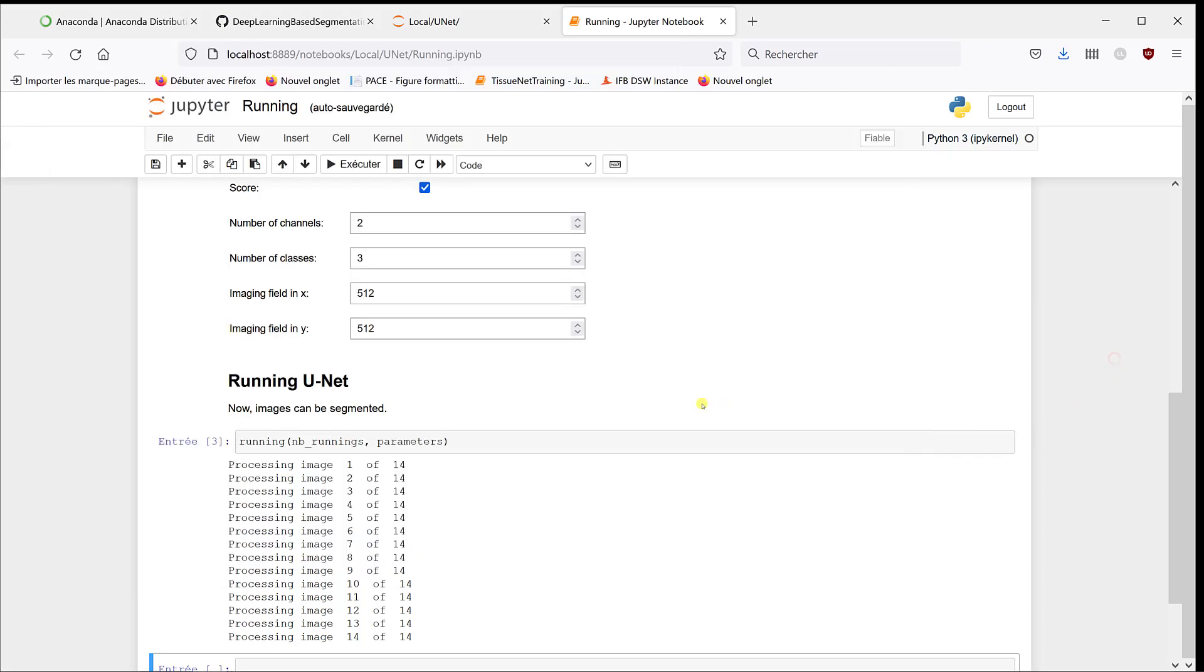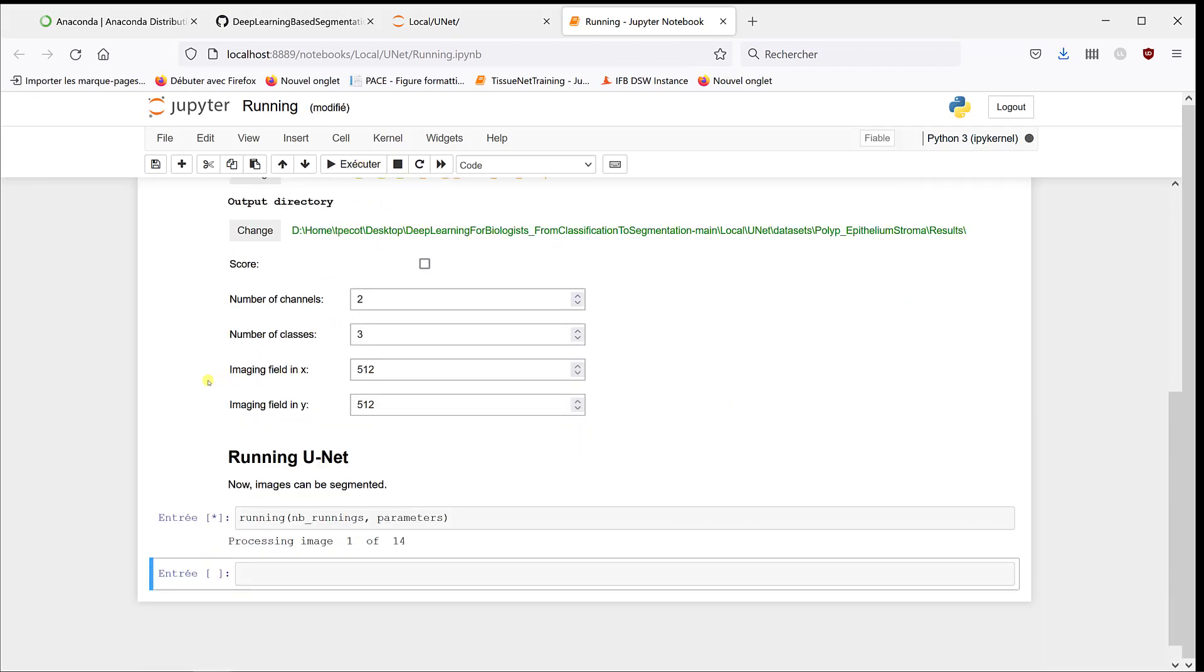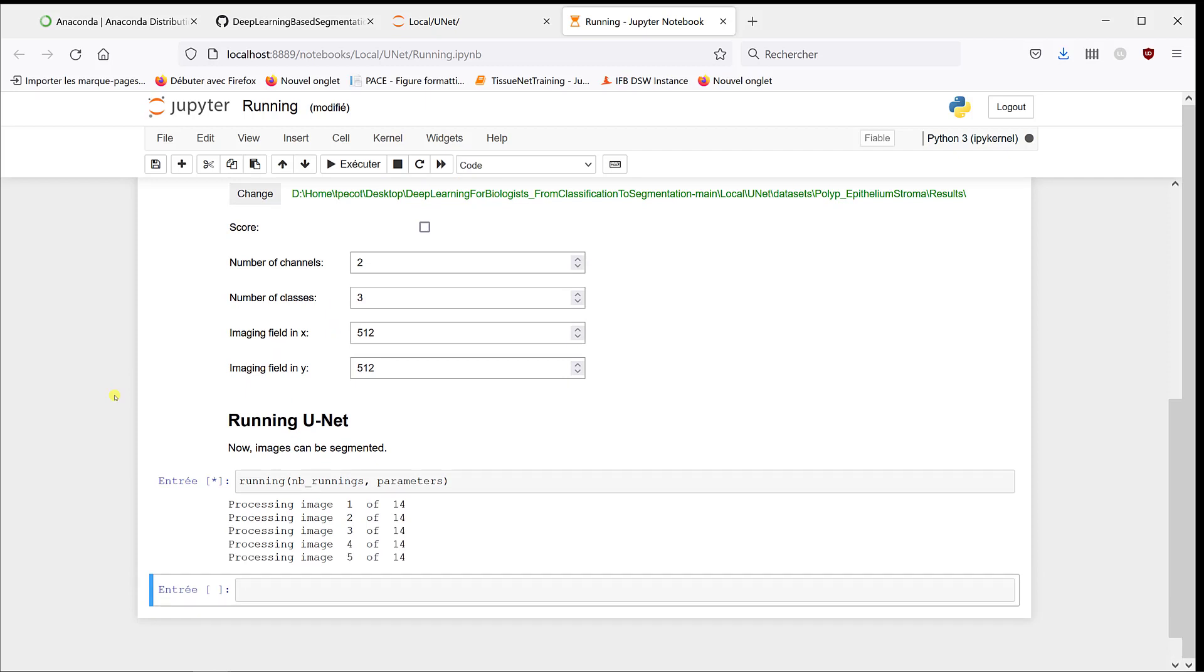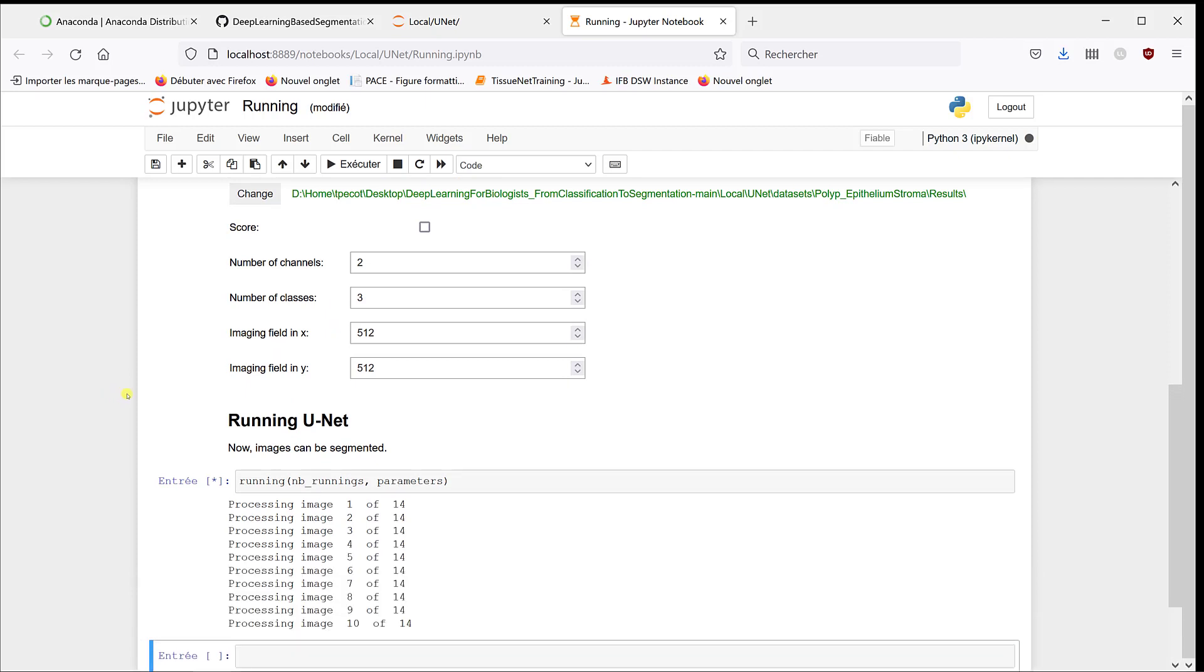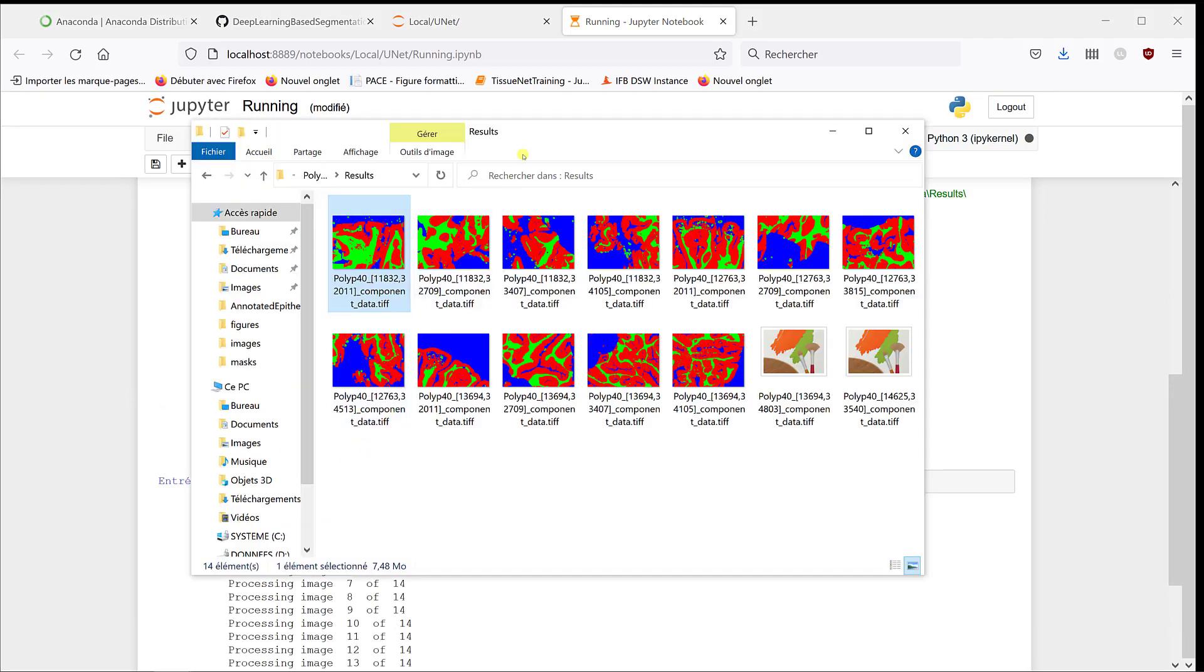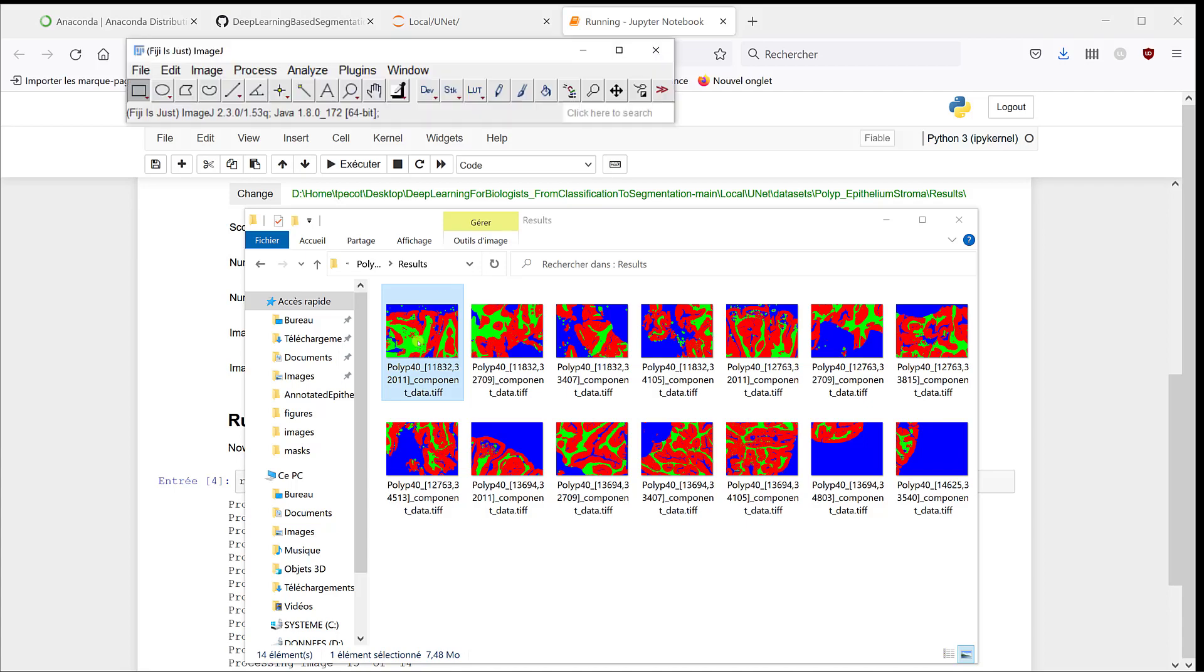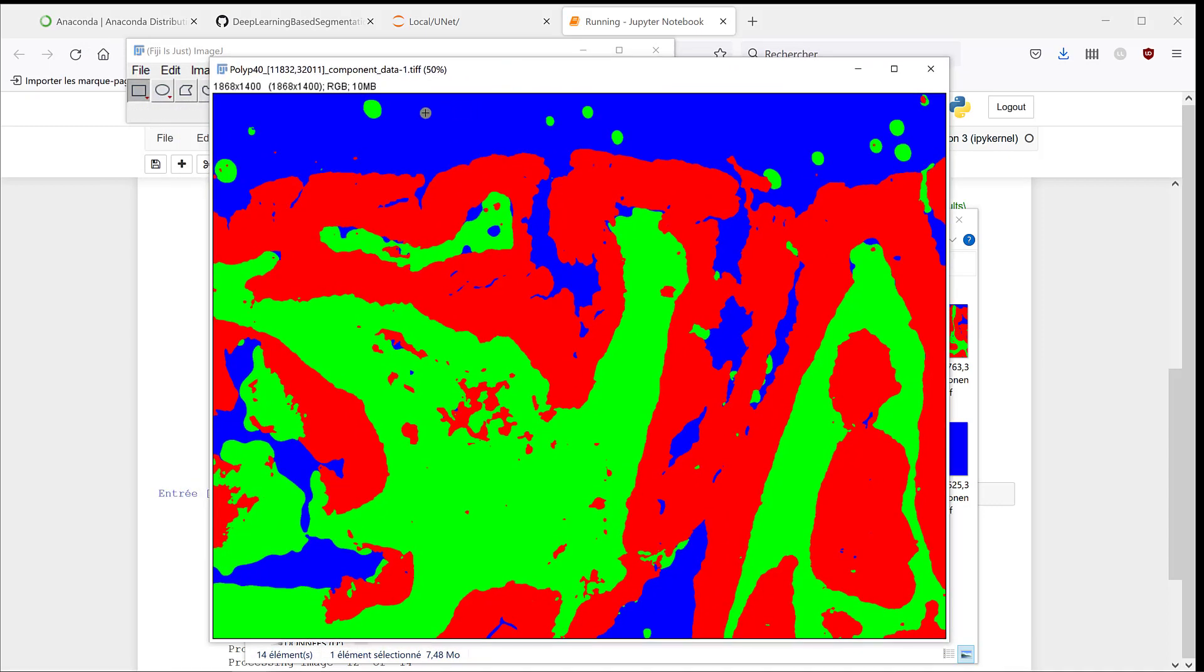Now, if you directly want to have the classes, you can go back to the notebook and then check score. So as I said before, it's going to compute and at each pixel it's going to assign the class that obtains the highest score. So now if I go back to my results, we can directly look at the results because it's just RGB, where here it tells us background, here is stroma, and here is the epithelium.